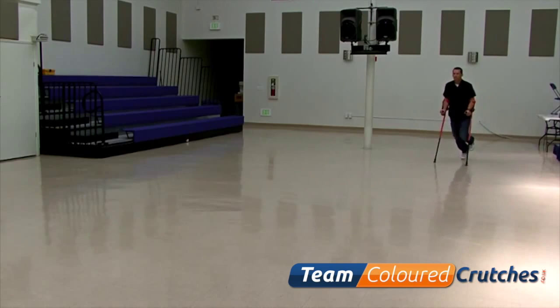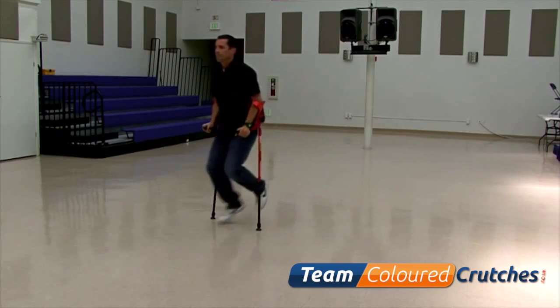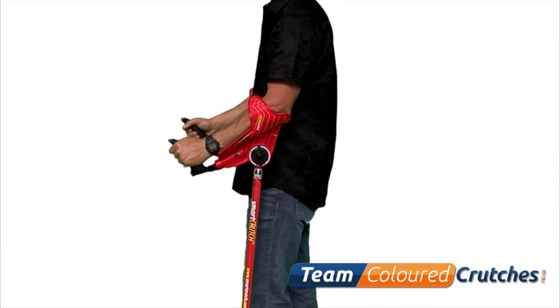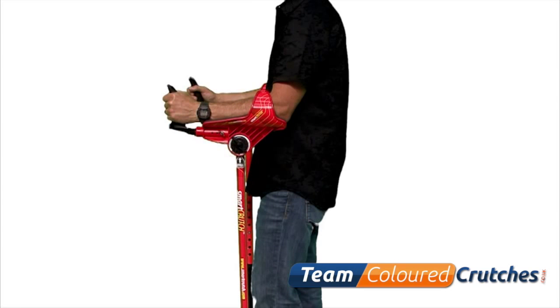If you are using smart crutch for non-weight bearing use — that is where you are not able to put weight on a specific leg — setting position number one, as initially recommended, will offer the most stable feel. Once you become familiarized and comfortable on your new crutches, or if you have previous experience using forearm style crutches, you can go ahead and experiment with new angle settings to meet your personal requirements.